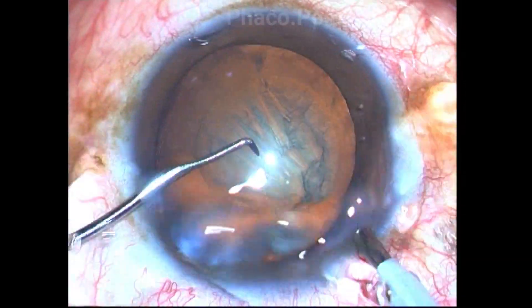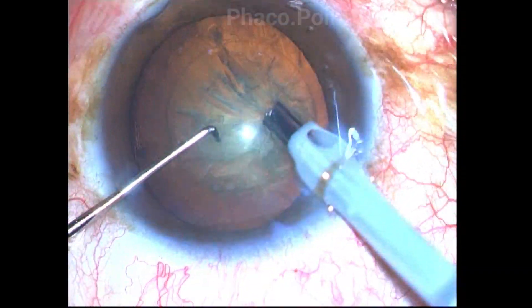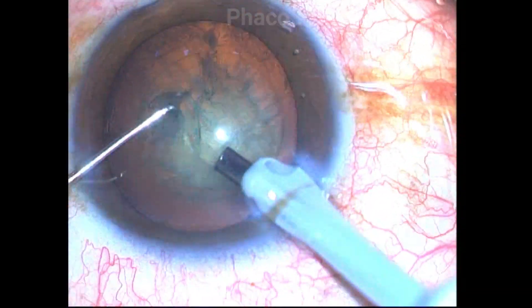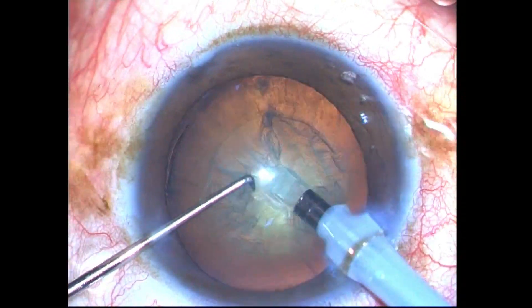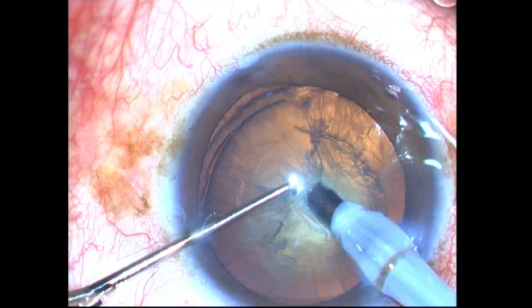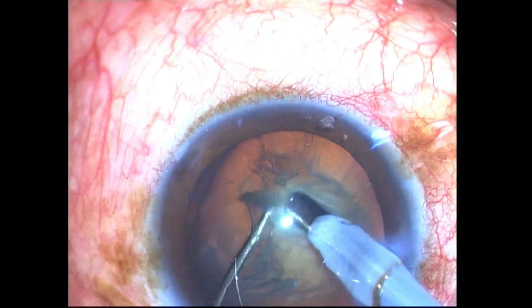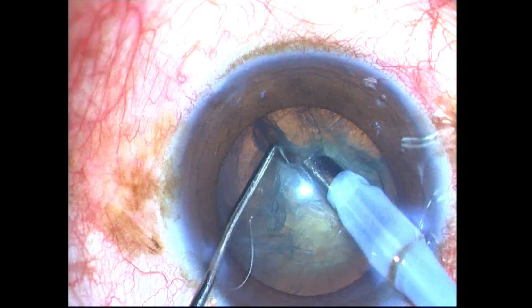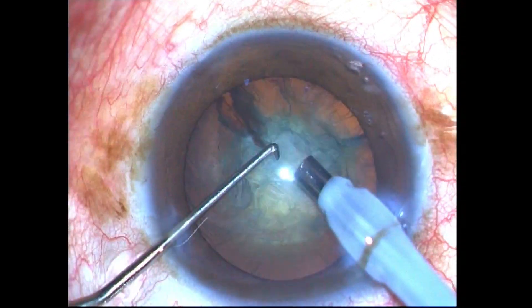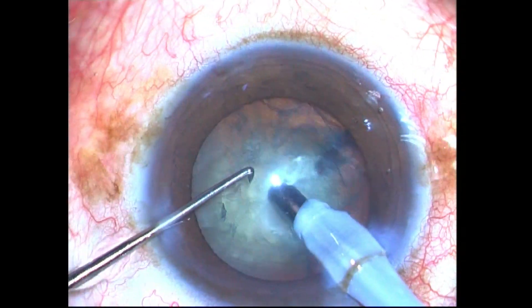In the direct chop, the first chop I do is not ideal because I am burying the facotip a little horizontal. This is because I initially think the nucleus is softer than it actually is, which gives me an unequal and uneven crack separation. It is then I realized that this patient has a very dense central nucleus opalescence of at least grade 3.